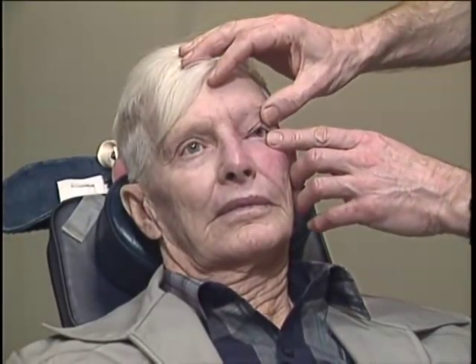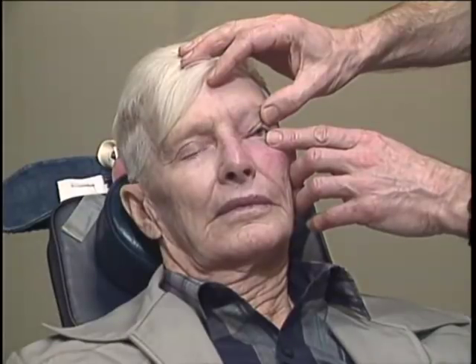I'm going to demonstrate that the blink is a lot weaker now on this patient. Blink your eyes now. I can control much better the power in his eyelids than before — don't have to fight them nearly so much.